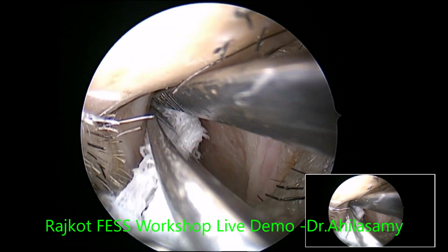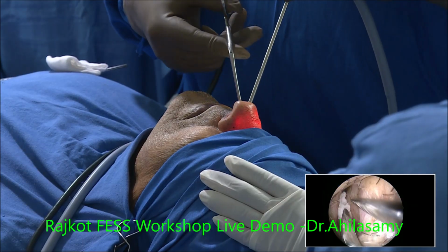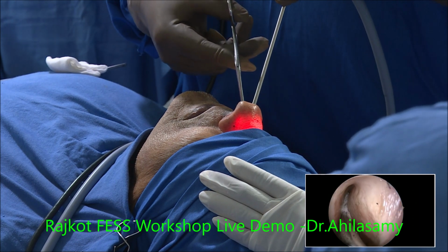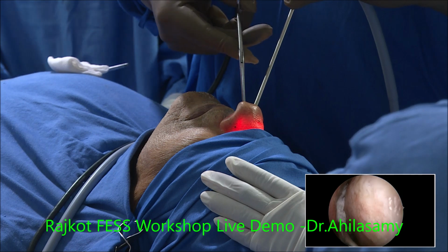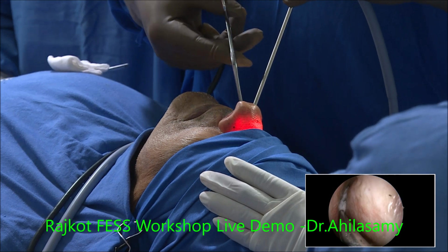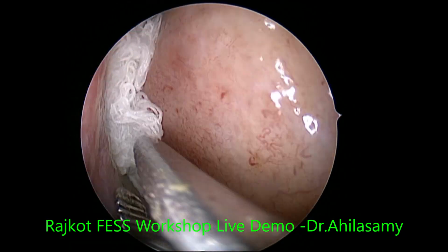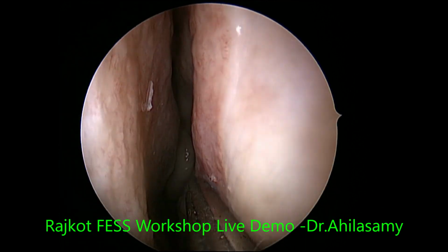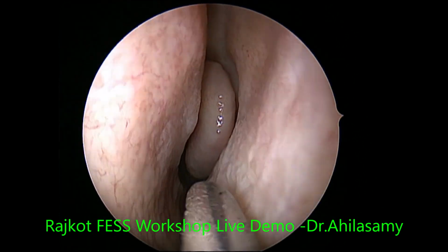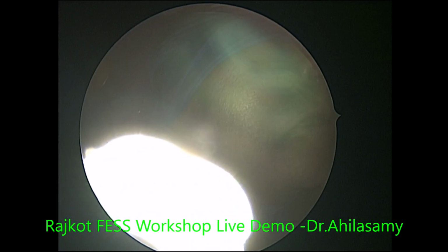I am gently packing the nasal cavity repeatedly. Are you getting the external picture or the endo picture? Show the endoscopic picture and put the external picture in picture. Now we get endoscopic. So I pack very gently to get more working space.